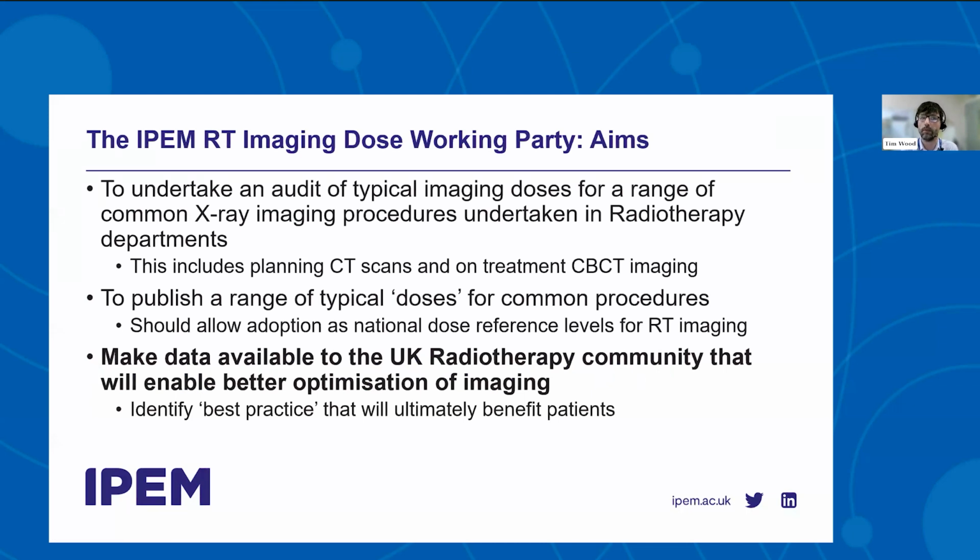Okay. So we formed the IPEM Radiotherapy Imaging Dose Working Party, and the aim of this was to undertake this audit of typical imaging doses for a range of common X-ray imaging procedures undertaken in radiotherapy centres across the UK. So it included the planning CT scans, it included the treatment cone beam CT imaging. There were plans to look at 2D and stuff, but we just have not had the time.